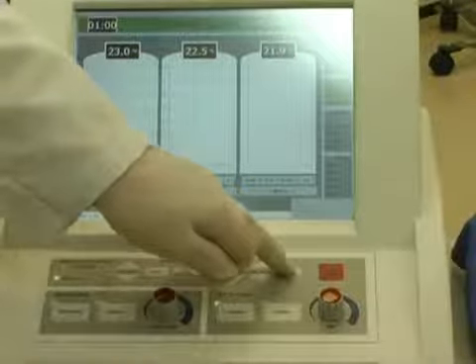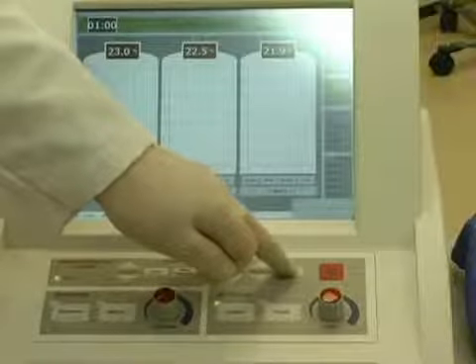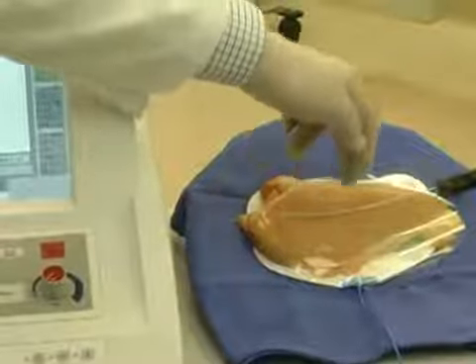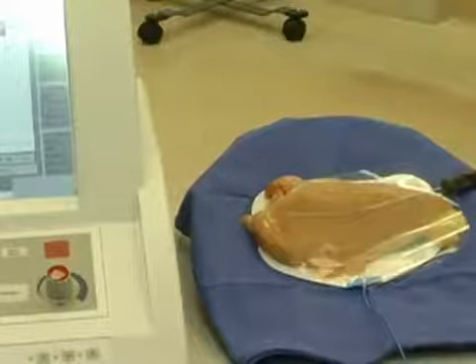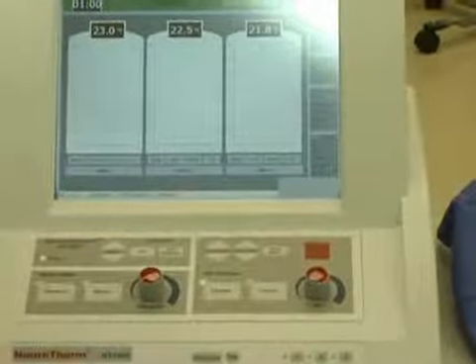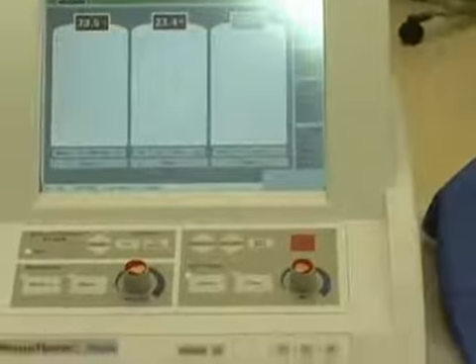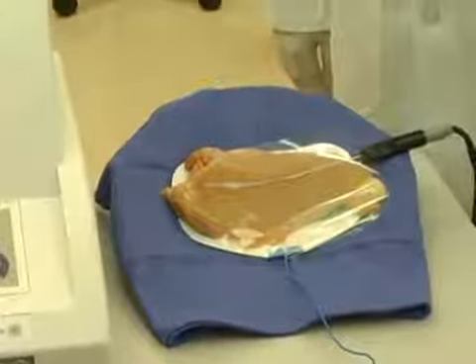You simply press auto start and the NT1100 will go through a 5-phase process where it will ablate first between probes 1 and 2, next between probes 2 and 3, then probe 1 alone, then probe 2 alone, and then probe 3 alone. Each of these ablations are going to be made at 80 degrees for 1 minute, although the clinician could choose any other temperature of their preference or any other time. So let's get started. Here we can see the ablation beginning to form between probes 1 and 2.